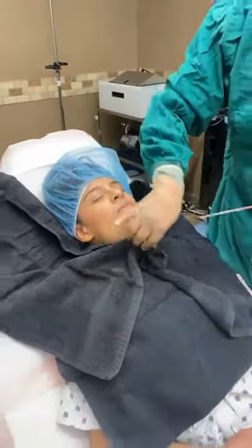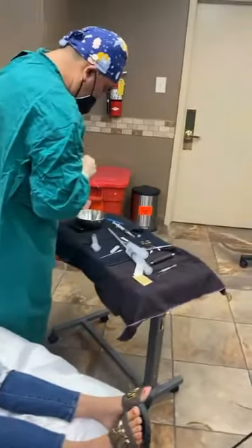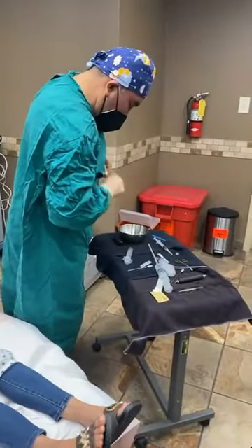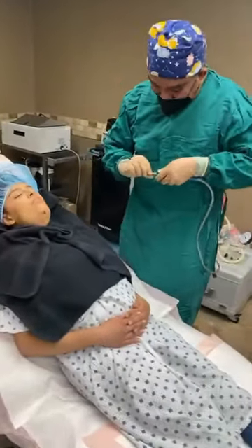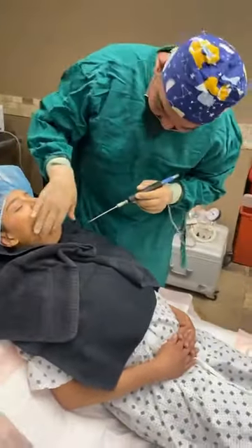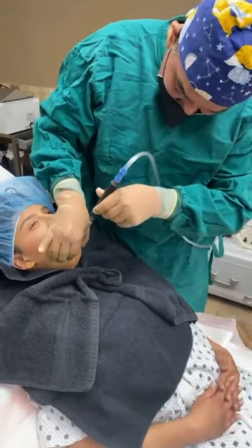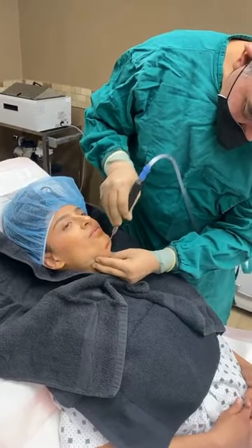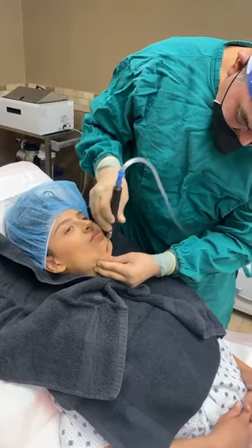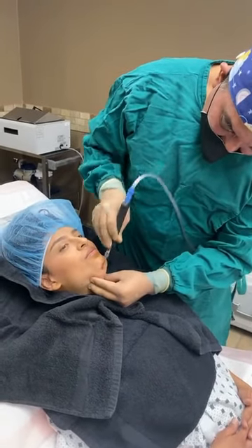Well, we're done there then. I'm going to try a slightly larger port for the fat right in the middle. I'm going to pass the cannula one more time though, for this area here. Again, I'm parallel to the skin. You don't want to jab too far deep.